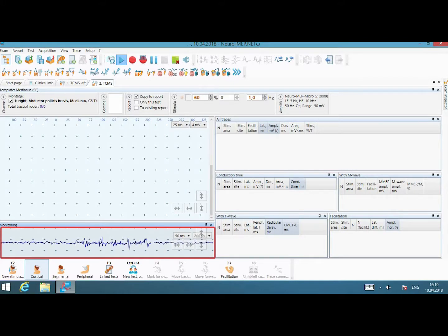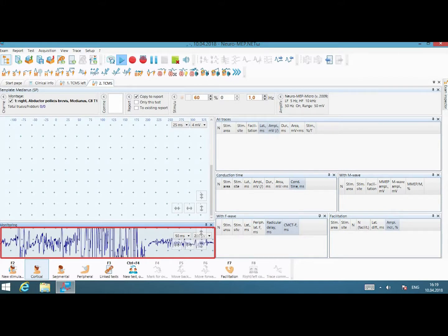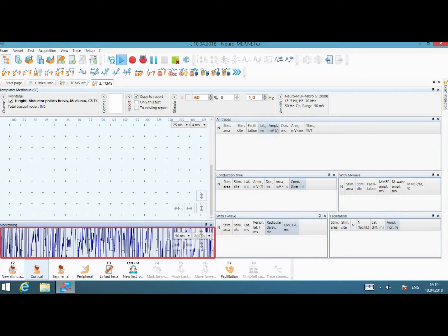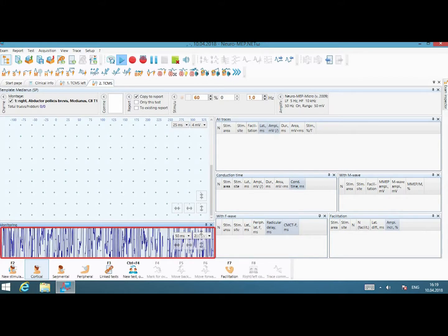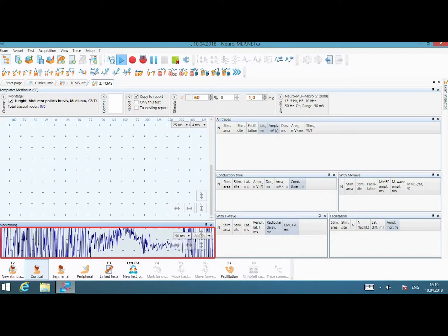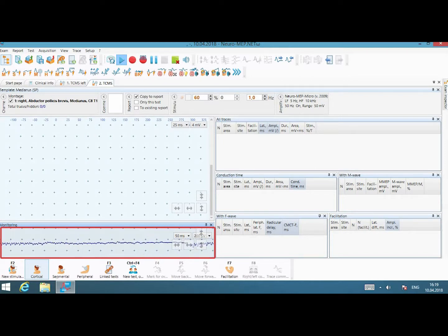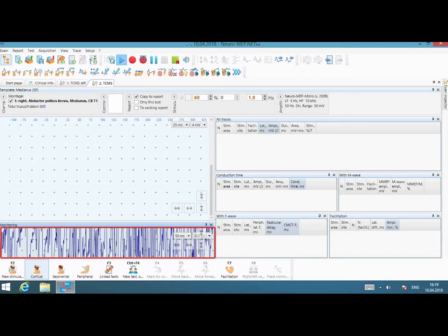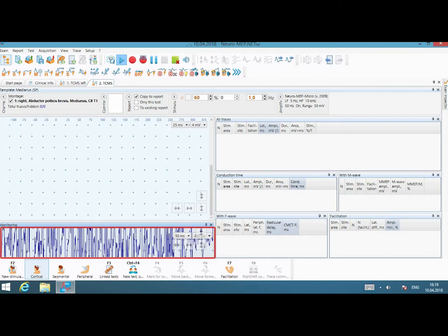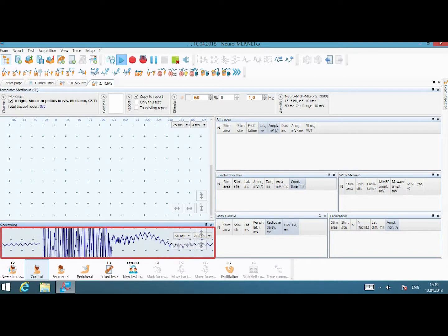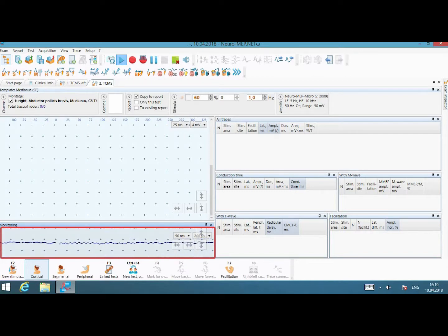So if I ask you to contract the muscle, you see this is the EMG. Relax. Nothing. Contract. EMG. Okay. Relax.